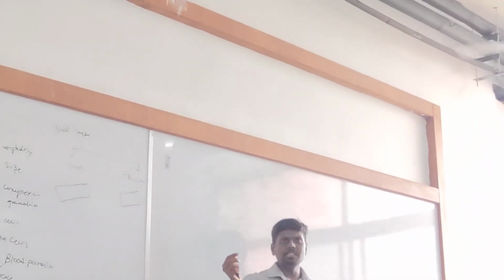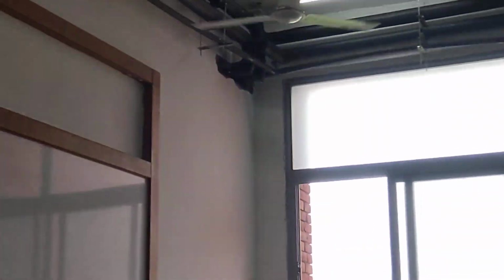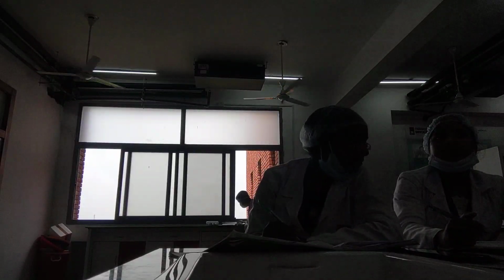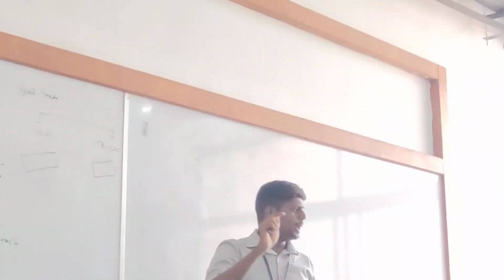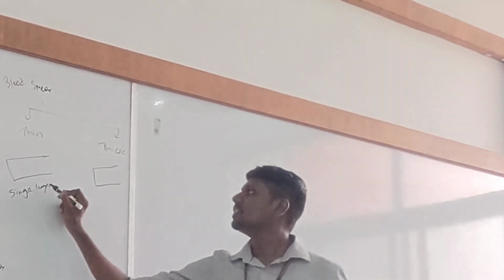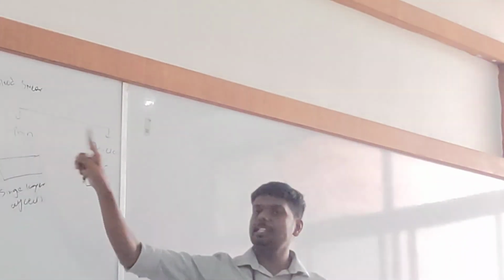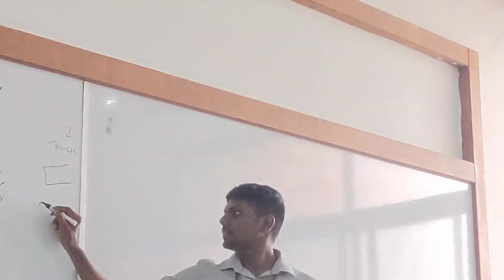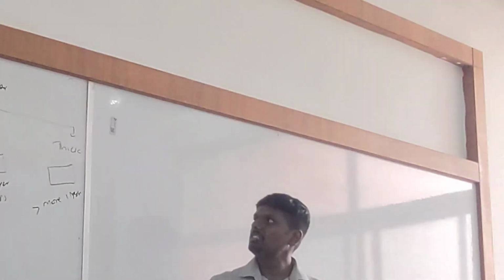Yes. Thin means a very pale, very slight, transparent layer. It can be stated as a thin layer, but there is one technical word, monolayer. Single layer of cells. We have to achieve a single layer of cells. That is called a thin smear. If more than one layer is present, that is called a thick smear. Greater than one layer will be a thick blood smear.